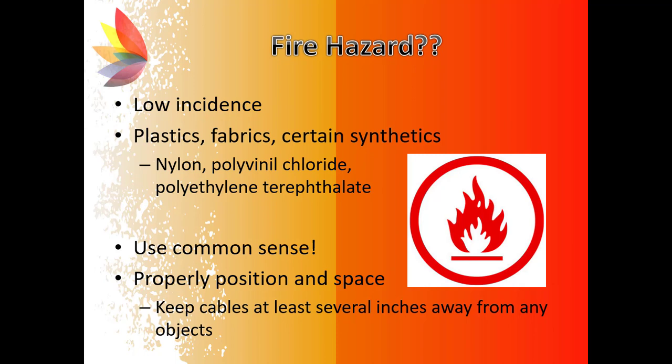Any plastics, fabrics, or certain synthetics that are made from nylon, polyvinyl chloride, or polyethylene terephthalate pose a risk for fire. Use common sense with your patients and the application of diathermy. Make sure to properly position the patient and be aware of your surroundings. This can all help to prevent fire risk. Keep all cables at least several inches away from other objects in the clinical setting as well to help reduce the risk.